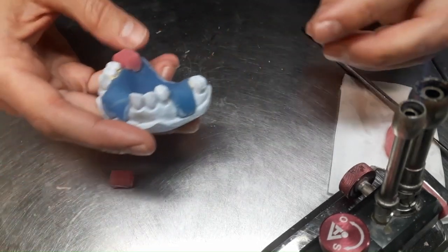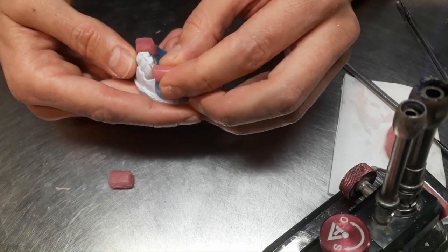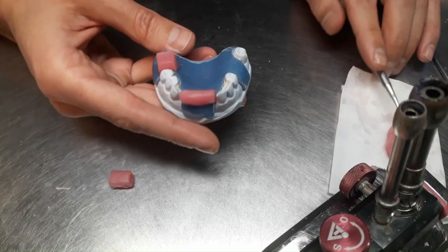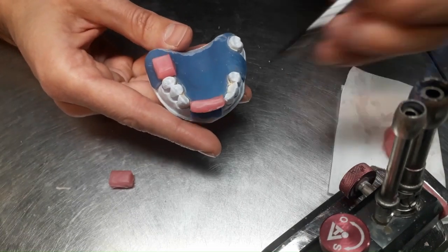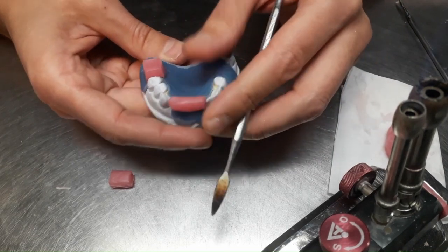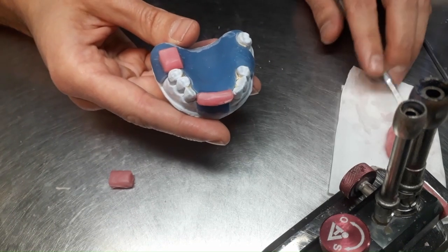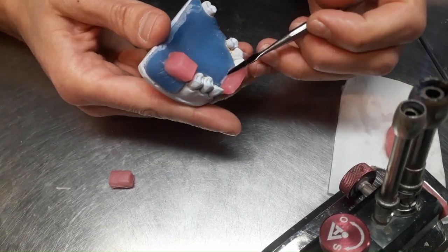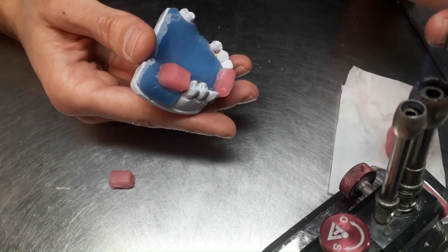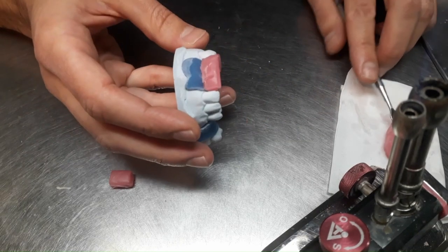of a molar. The block in the frontal region has to be placed on the curvature of the arch. As you can see, it mimics the shape. It has to be in the same position as the central incisors would have been. Central, lateral incisors. Just try to replace the teeth that it represents, so to say.